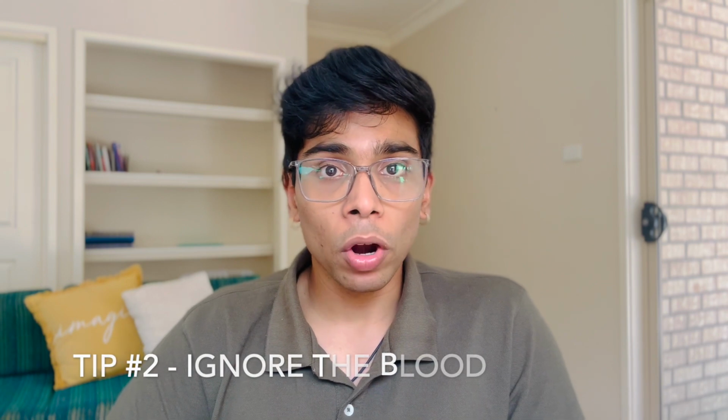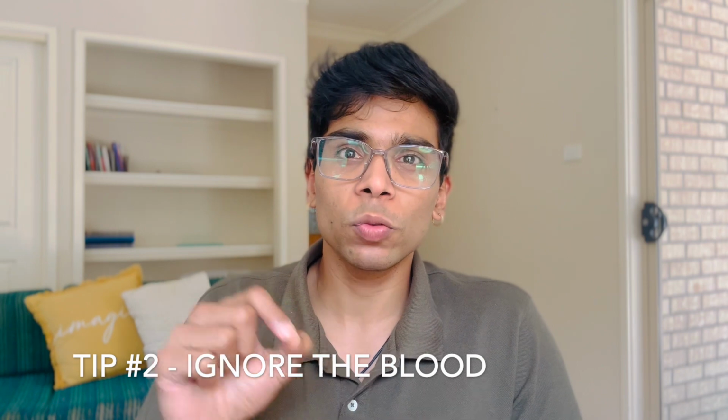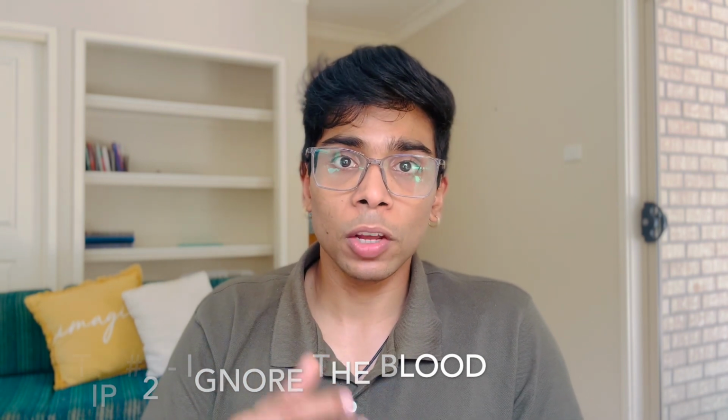This brings us to our second point, blood. There will be a lot of bleeding. Bleeding is expected, and wasting your time suctioning or swabbing the surrounding area isn't going to do much for you, the procedure, or for the patient. The quickest way is to get the tube in and inflate the cuff, and that will cause a tamponade effect, which will automatically stop the bleeding.